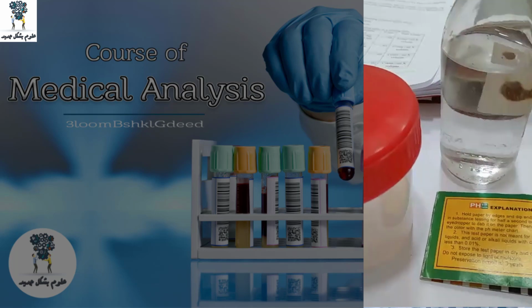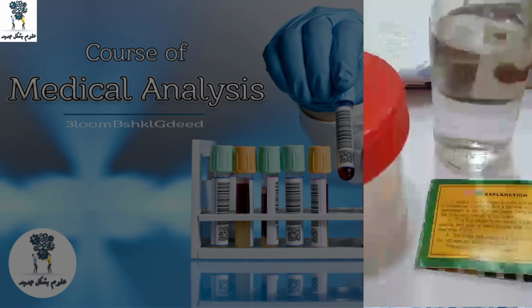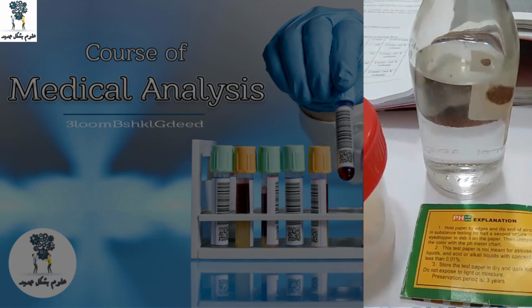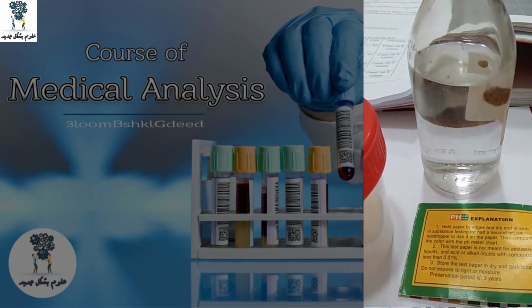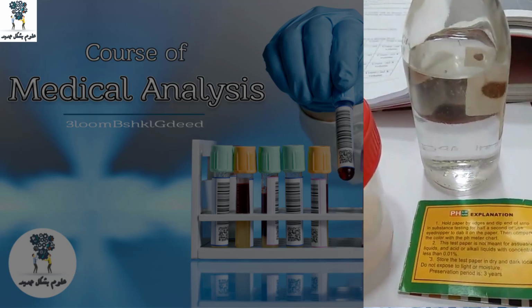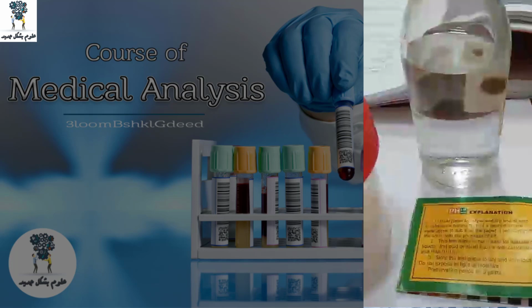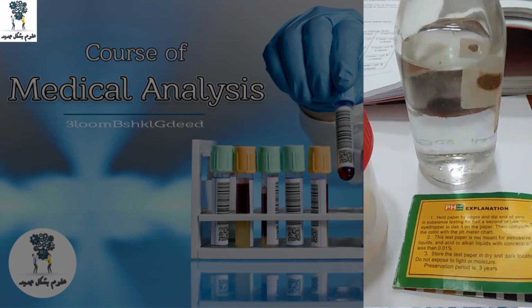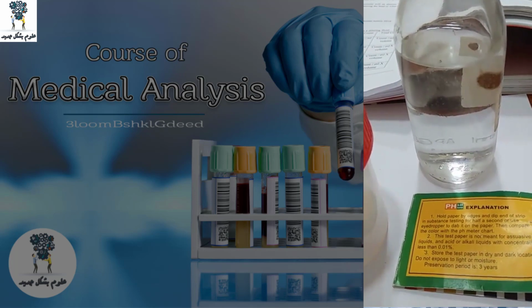We will identify the percentage of the sperm in our case that is progressive, actively moving, or non-progressive, that can't move quickly. So we will have a percentage in our report, and I will discuss it later. How can we get that percentage for the sperm in the slide?